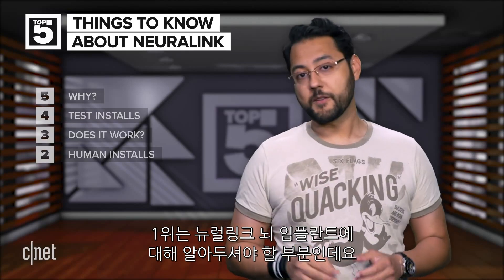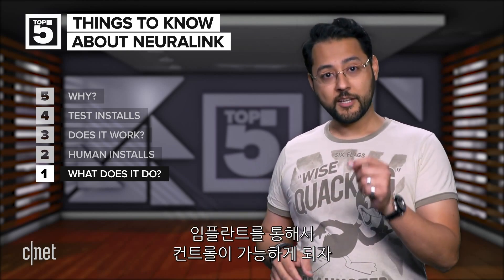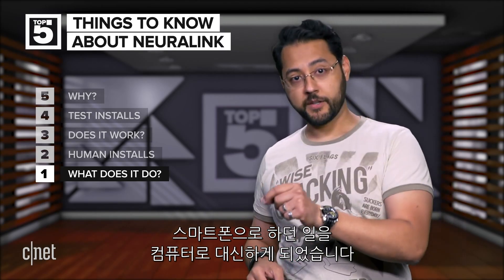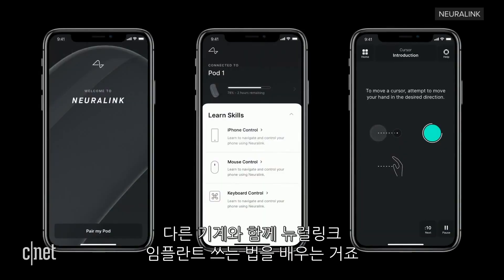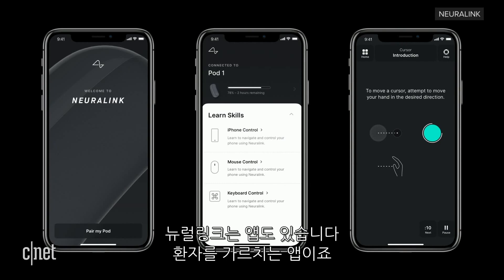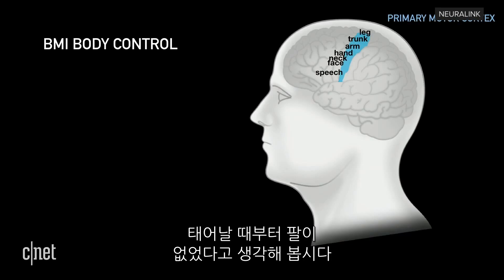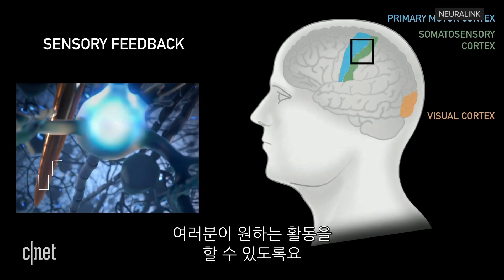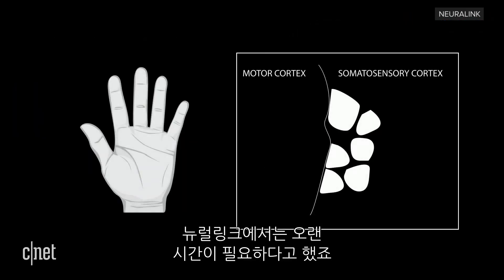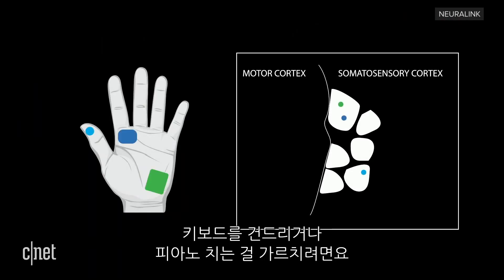The number one thing you should know about the Neuralink brain implant is: what the heck will this do? The first product is focused on control. Patients wanted the ability to control a mobile device — no caretaker necessary. Once that control is possible through the implant, the phone output could also be redirected to a computer as mouse and keyboard inputs. Neuralink has an app to teach patients how to use the implant in conjunction with other devices. For example, imagine if you never had arms and you had to pick something off a table — you would use the app to connect brain activity to the movement you want to accomplish. Neuralink says it's a long process, comparing it to learning how to touch type or play piano.